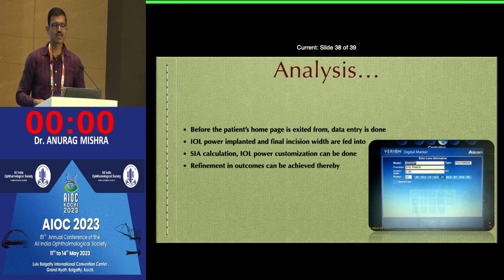In the end, just before concluding, it also gives you the opportunity of analyzing your own surgeries before the patient's home page is exited from, once data entry is done. Finally, what did you decide to put in, what spherical, what cylindrical power, and the SIA calculation, IOL power customization, if you need to do them. Of course, with the modern day IOLs coming in from good brands, it does not need the IOL power or the A constant customization to be done at all.